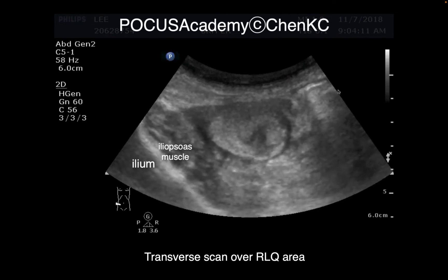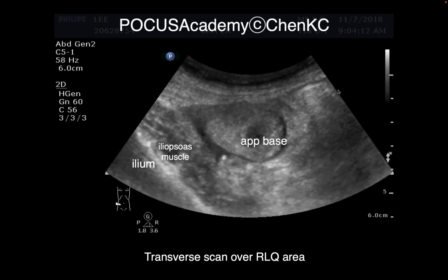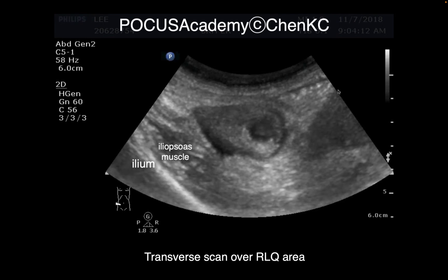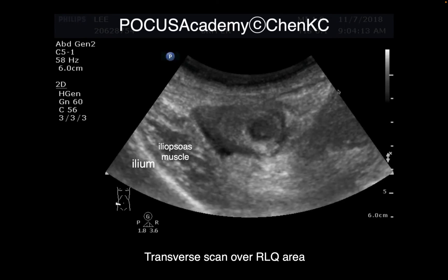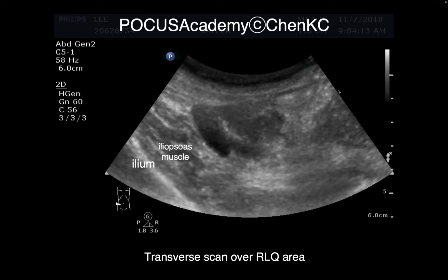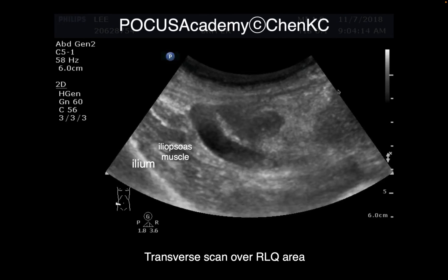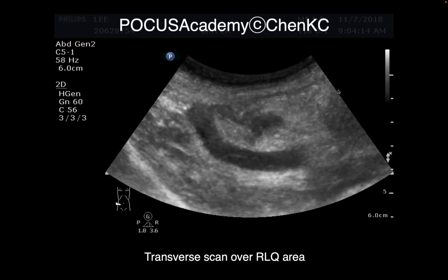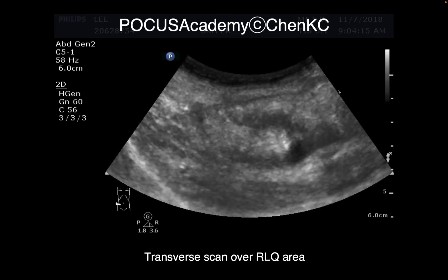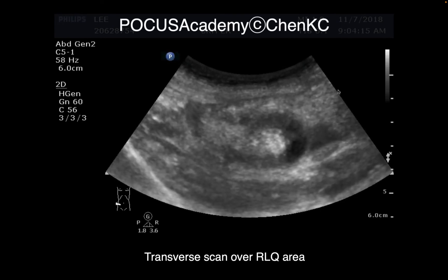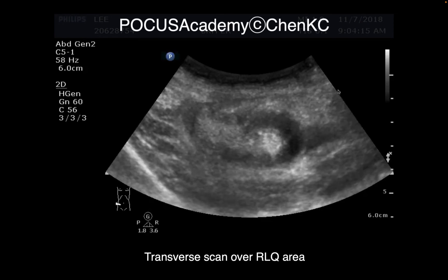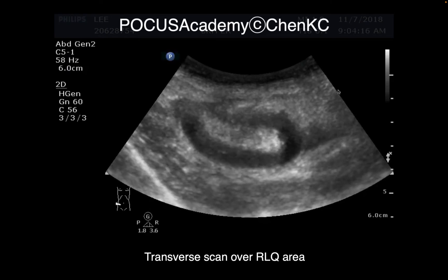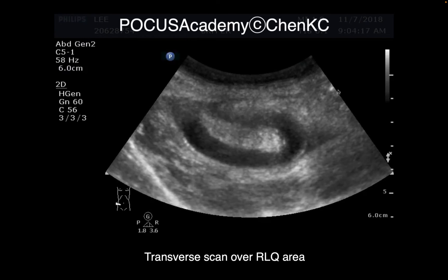Scanning transversely for most parts of the GI structure is quite important because in that way we can observe the patterns like a CT scan. In this case, we started from the cecal base landmarks and appendix. We see the appendix in a circular shape.